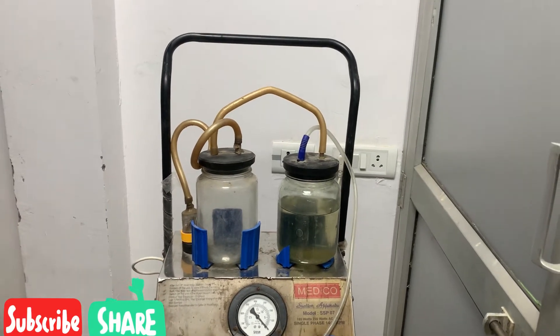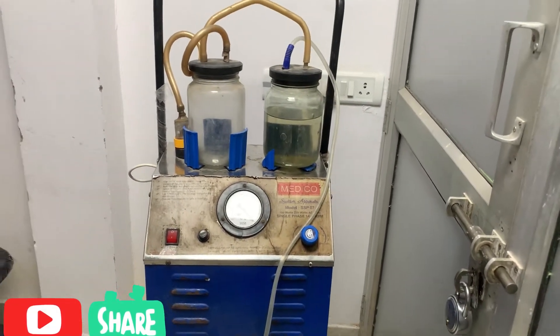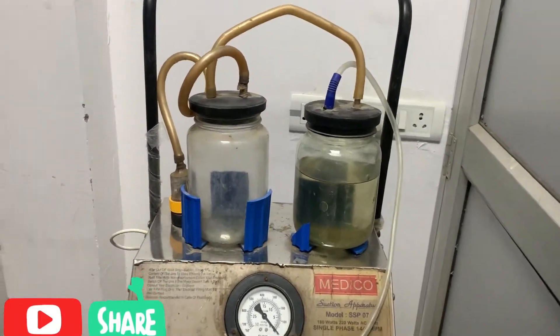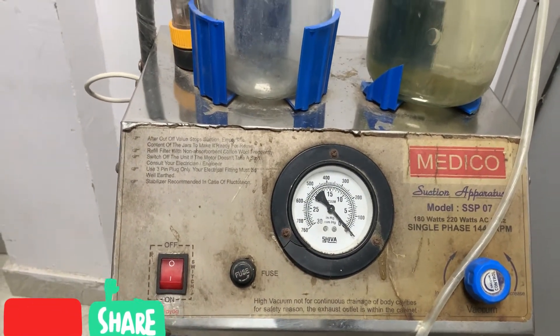Hello guys, welcome to Excellence Biomedical Engineering. On this video I will be giving you guys a brief about this important device called the suction machine.